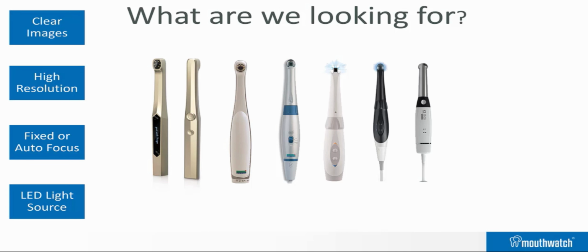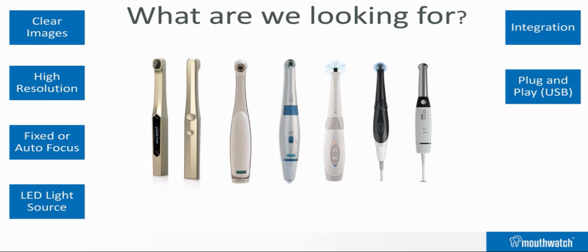We want to make sure that our camera has a good light source. We want to make sure that it has seamless integration with our imaging software. We want it to be plug and play, ready to go. We need to pay attention to the length of the cord. We need to make sure that we have enough room to work around our operatory.